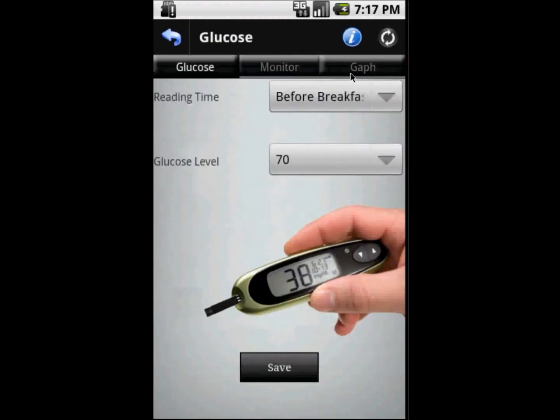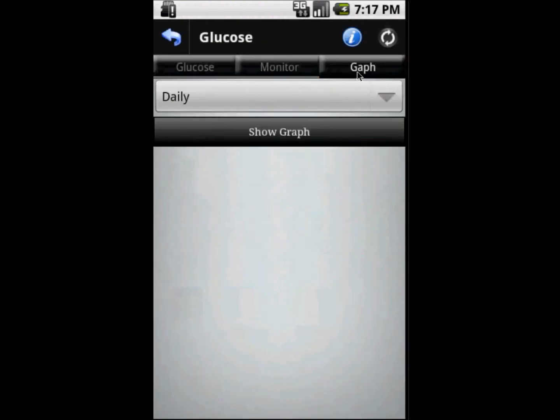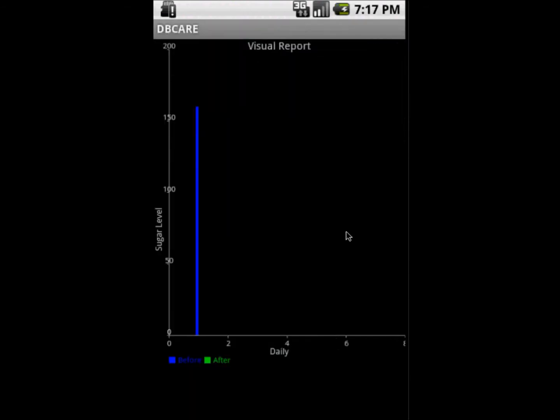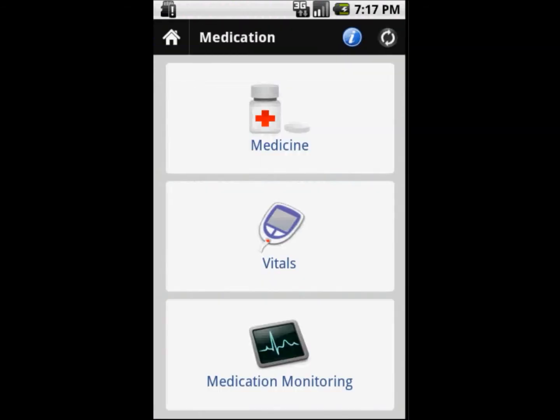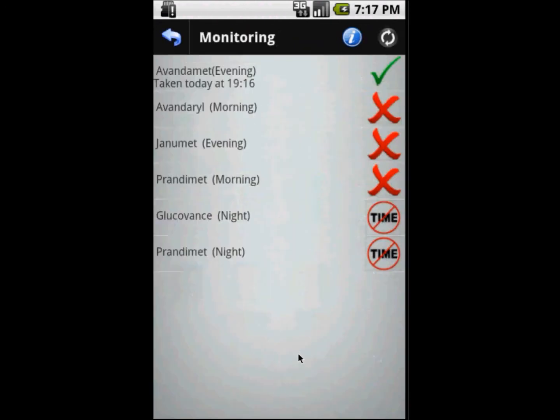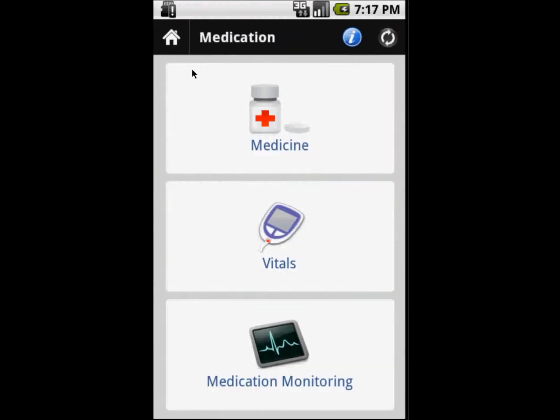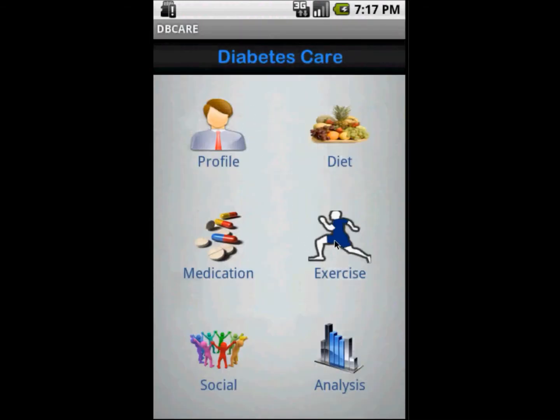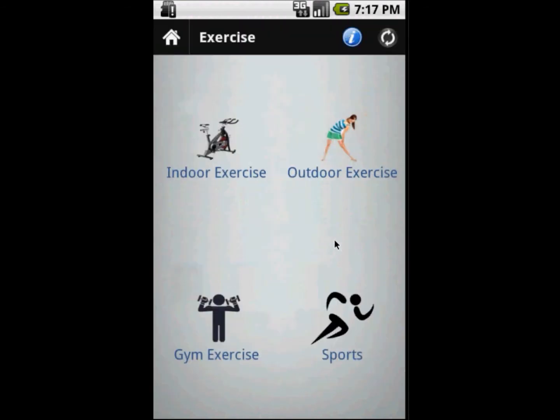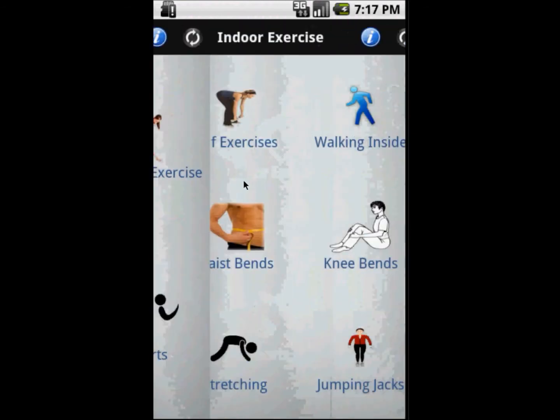You can monitor your glucose level in graphical format to see what your glucose level was over time. This is the medication monitoring view — a tick shows that the medicine has been taken, a cross shows it has not been taken, and the time indicator shows that the time has not been reached yet.